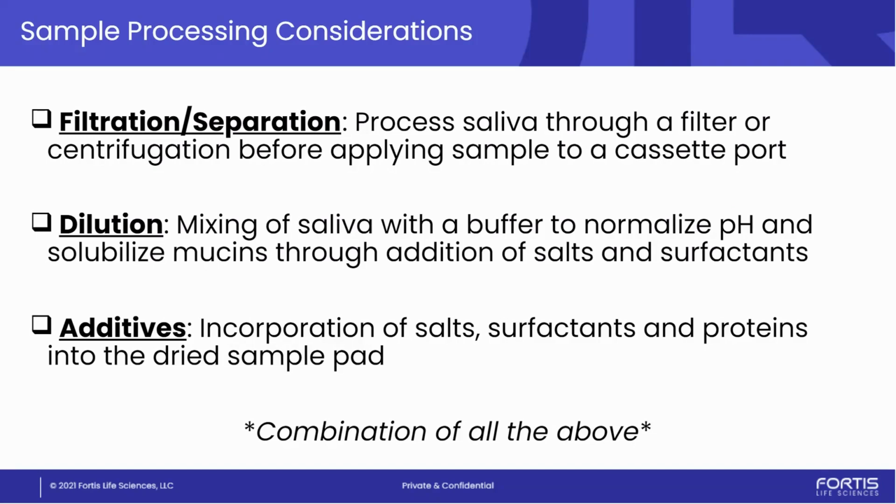Proteins for blocking, for example. Saliva is a snapshot of your blood, but it comes with a lot of constituents and proteins and enzymes. So it's important that we have some level of blocking involved somewhere. And again, typically in the sample pad, but there are creative ways to do this as well. You can lyophilize these in tubes that the sample gets put into before it gets dropped into the device, and so forth. And really, ultimately, it's a combination of all of these things. It's not necessarily one or the other. It is a combination of all.